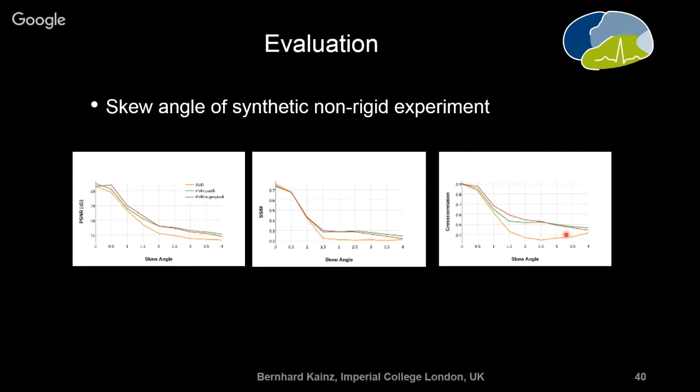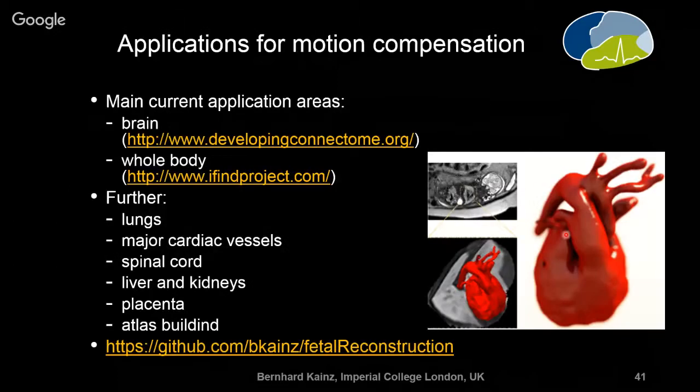So there is some kind of a thin elastic motion involved, which you couldn't just reconstruct by using standard slice to volume reconstruction. This is currently used quite widely. We have big projects which all rely on that. For example, studying the human connectome at an early stage, so how all the connections in the human brain develop from 20 weeks or even 18 weeks now up to 2 years, 3 years, and then through adulthood.